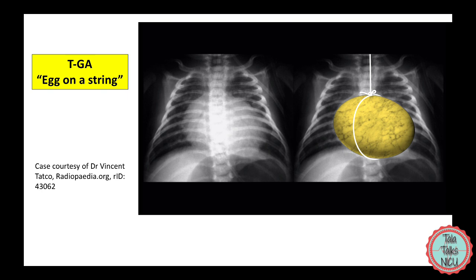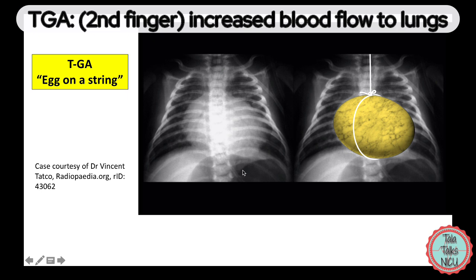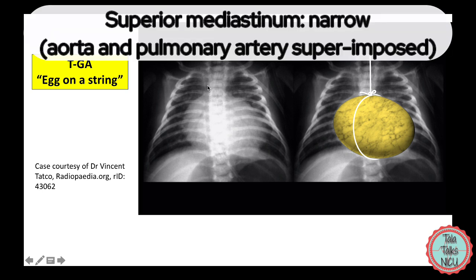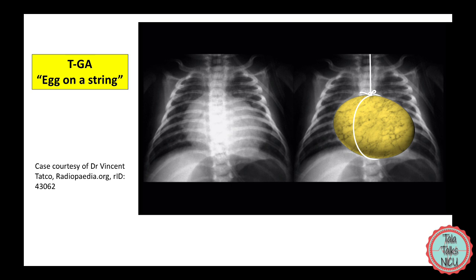Transposition of the great arteries is number two — the index finger of the 'I love you' sign. Again, we'd often expect to see increased blood flow to the lungs. The classic sign for TGA is called 'egg on a string,' which is honestly pretty hard to appreciate. The superior mediastinum is normally super narrow in TGA because the two great vessels — the aorta and the pulmonary artery — instead of being side by side are kind of on top of each other, superimposed, taking up a much smaller area. So you see a really skinny upper mediastinum and generally a generously sized heart.